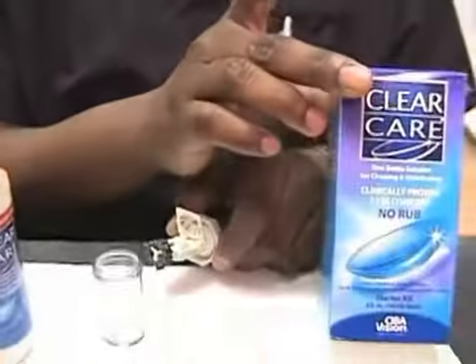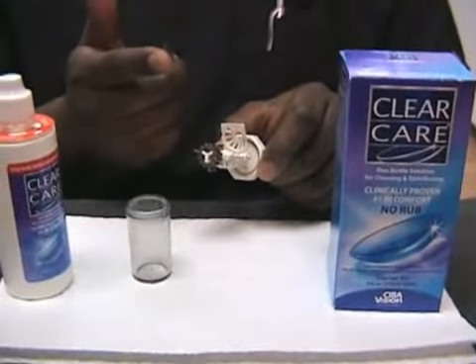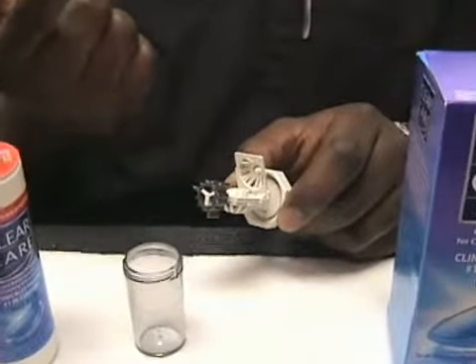Okay, I'm going to demonstrate how to use Clear Care. Now, this is a disinfectant solution there. Now, you cannot put this directly on the contact lens and then put it directly in your eye because it'll burn, and it doesn't feel good, and you would hate us for it.